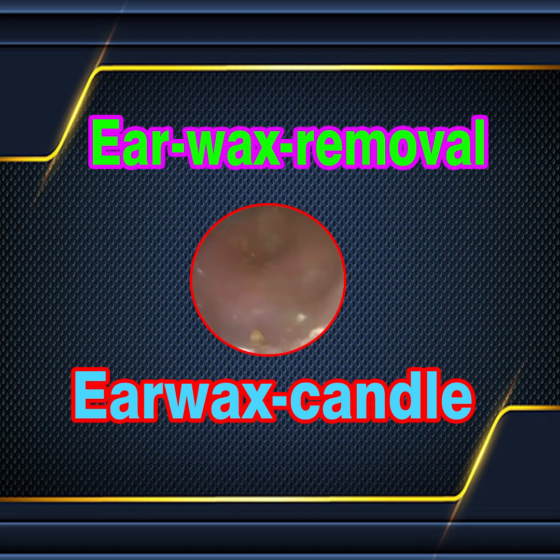So I'm just mopping up near the entrance here. So I'm just with the Curette now, I'm coming backwards. With the design of the Curette, you can also start separating skin if you go in the reverse. Not as effective as when you go forwards, but that tip is, as I say, taped, and with the opening, the hole, the inside, you can see it really there. It can go underneath.